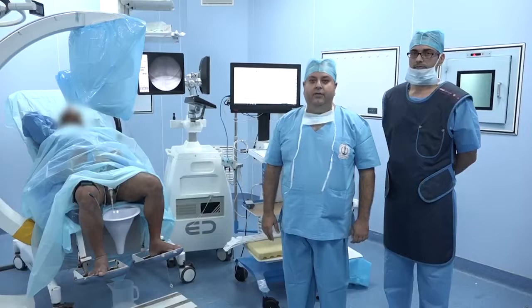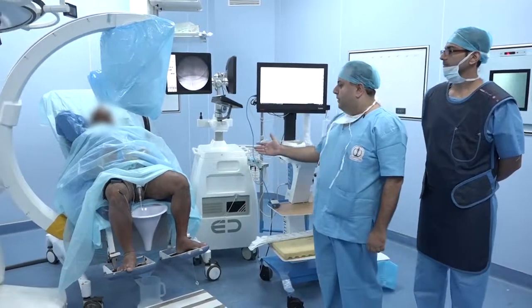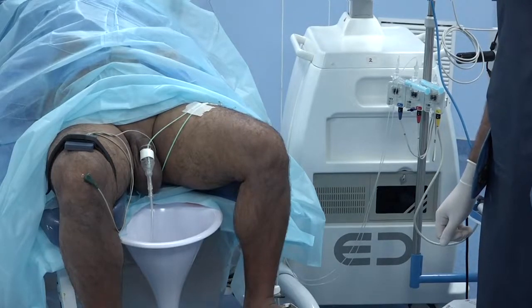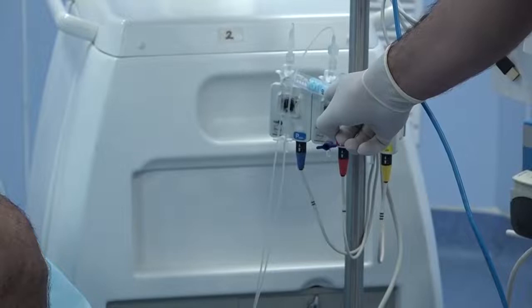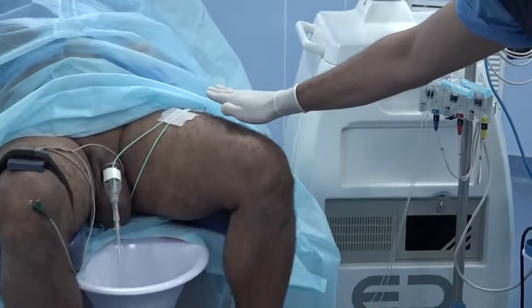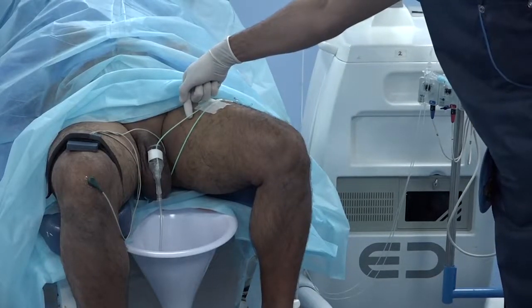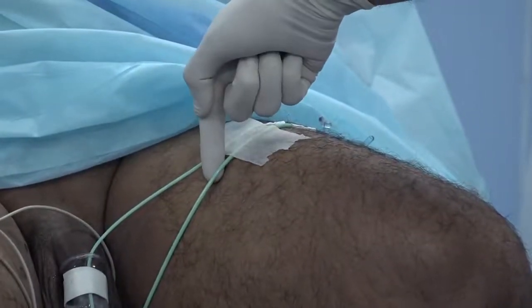Before we start, this is our urodynamic unit, this is our urodynamic machine, this is the urodynamic chair, and this is the C-arm. All procedures that are going to be demonstrated are as per the ICS standard good urodynamic practices. We are going to be using fluid-filled catheters with external pressure transducers. Pressure transducers will be at the level of the upper edge of pubic symphysis, and zeroing will be done to the atmospheric pressure. We shall be using a 6 French double lumen catheter to measure intravesical pressure and a 10 French rectal catheter to measure the abdominal pressure.